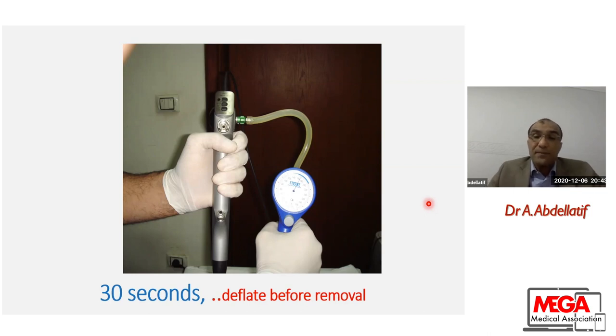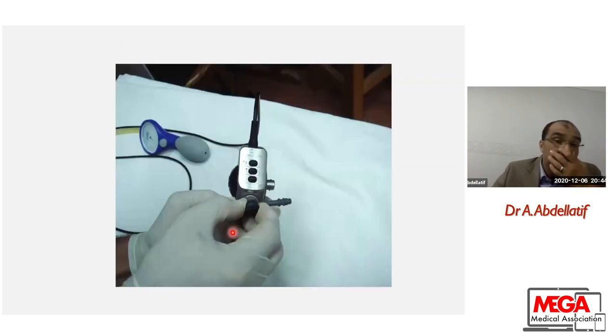Just remember, do not release this leakage tester before deflation. I have to push this button so that I relieve the pressure. Otherwise, the pressure will continue to be inside the scope. This will make damage to the scope.